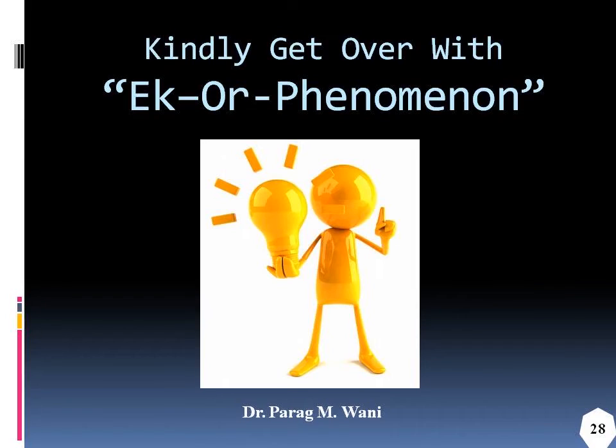To overcome this kind of cyclic fatigue, you should get over a phenomenon I call the "one more time" phenomenon. I've coined this term because every time I saw a file, I was tempted to use it one more time, thinking I would get more out of that file. And it breaks, and you think, "Arey yaar, I was going to throw this away now." So please get over it: as soon as the file's 3 or 4 cases are over at the max, or if you have any calcified, severely curved canals, just don't use that file again, and your breakage will definitely go down 90%.